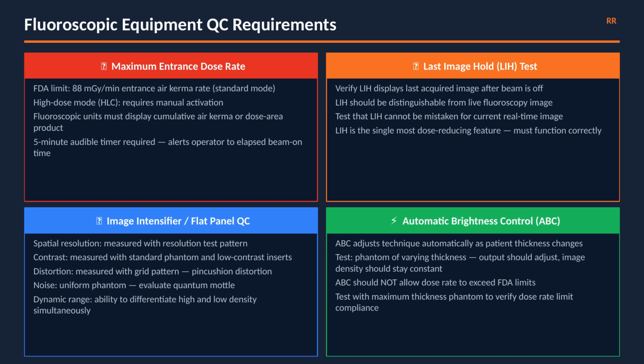Image intensifier or flat panel detector QC: spatial resolution tested with a resolution test pattern. Contrast tested with low contrast inserts in a standard phantom. Distortion tested with a grid pattern, pincushion distortion measured in the image. Intensifier systems: quantum noise and dynamic range assessed.